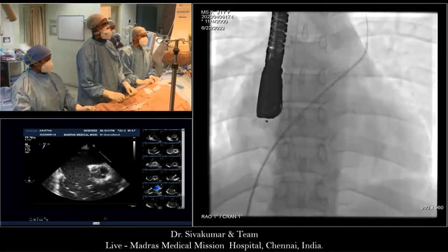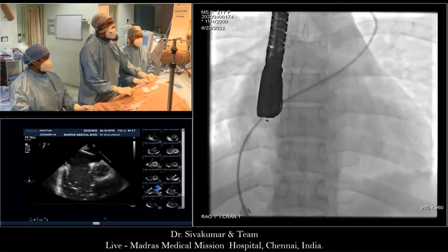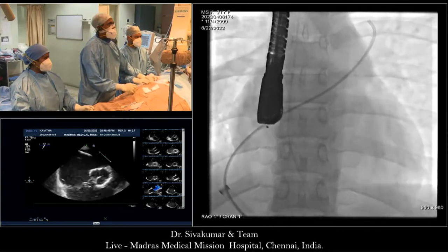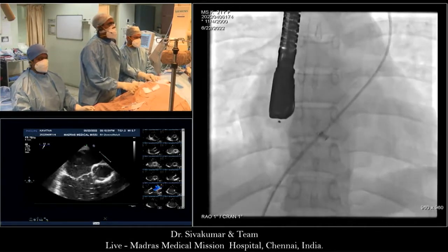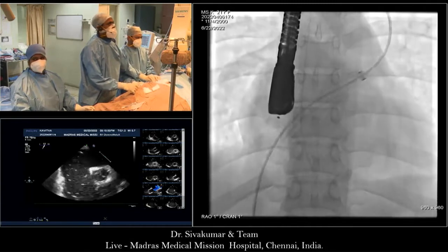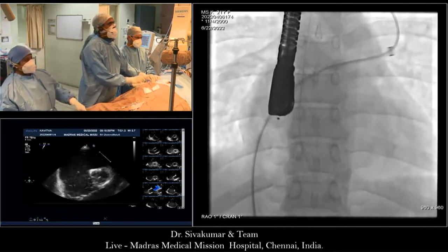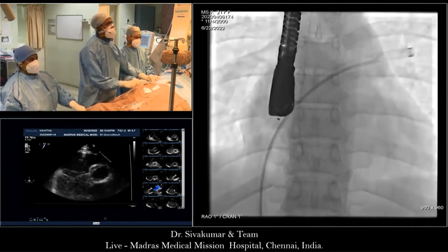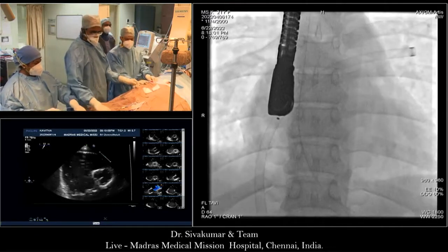Okay. So, Bharat, quick question. In your talk you mentioned multiple deficient rims, large ASDs are at risk. Here you look at the anterior superior rim, it's almost absent. Posterior rim also is. But I think the device will hold. Yeah. If there is no significant malalignment, which I'm not able to say with 100% certainty, the device will hold. I think these rims are good enough for the device to hold.